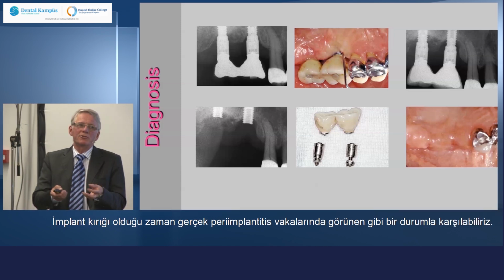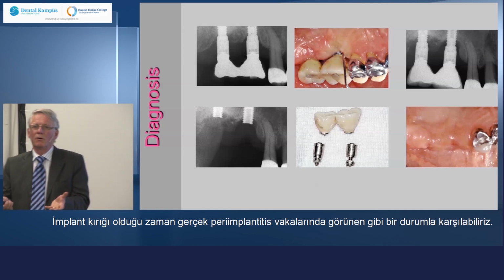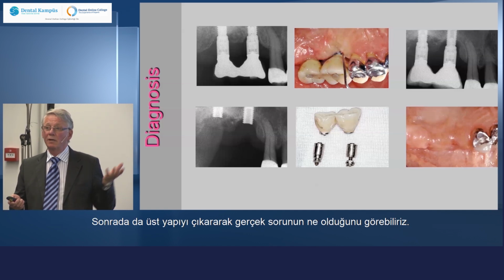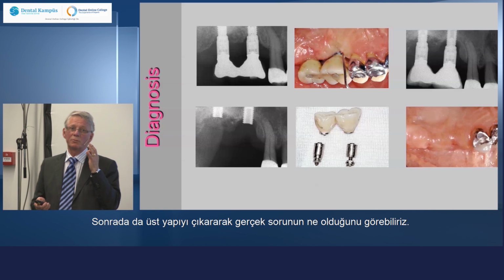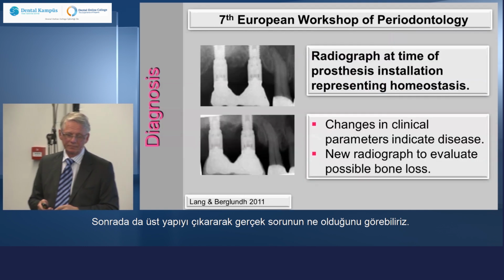So when you have fractures, you may have a similar situation. It looks like you have a true periimplantitis case. And then we are very lucky that we can remove the superstructure and see what is really the problem.